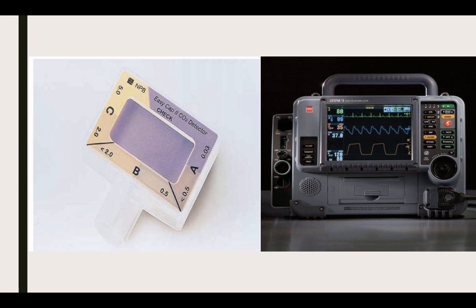Let's say we hook this up to an ET tube, we've just intubated our patient, we breathe through our BVM, and we're seeing, are we getting any carbon dioxide back? With this device, we want a yellow color. So yay for yellow is what we're looking for. If it stays purple, we aren't really getting any carbon dioxide back.